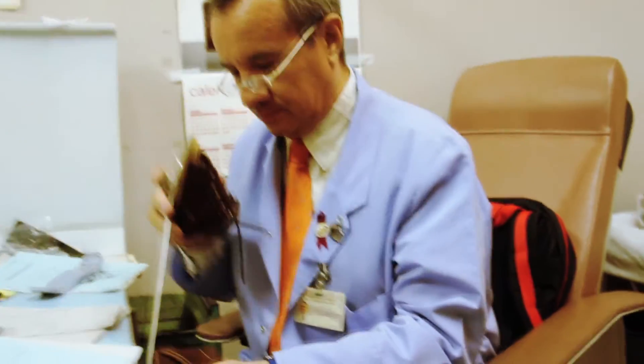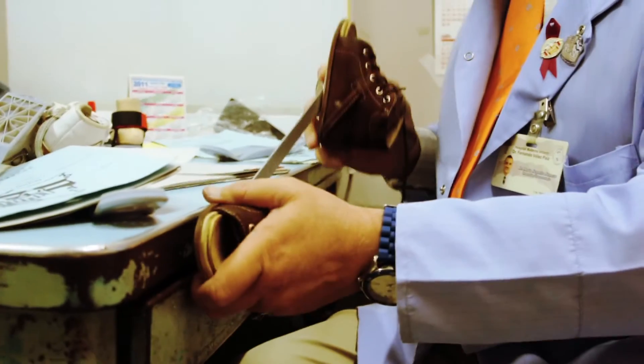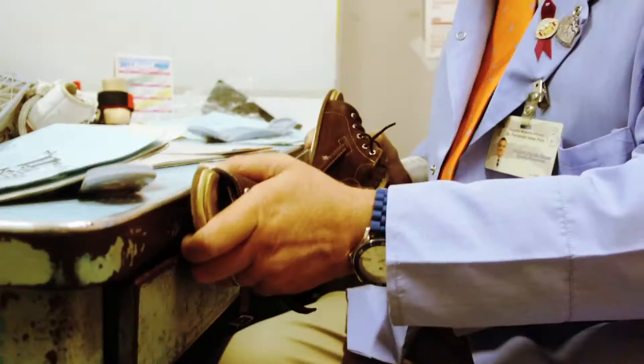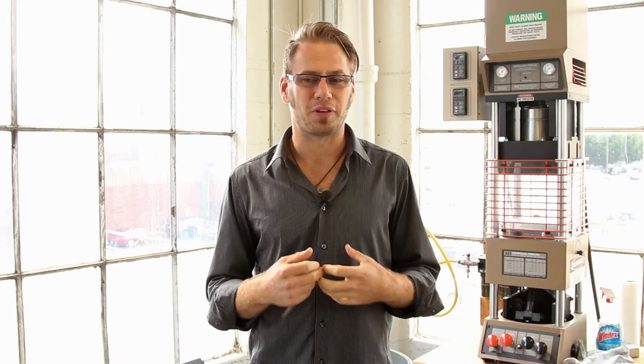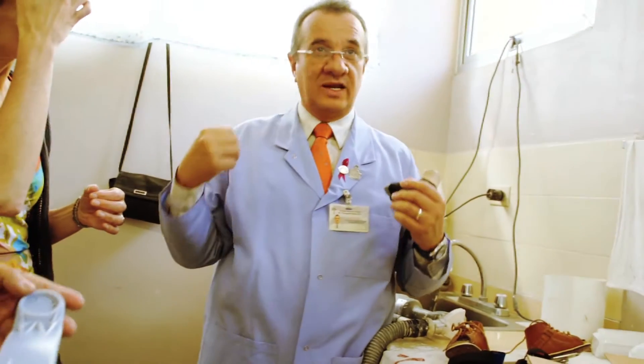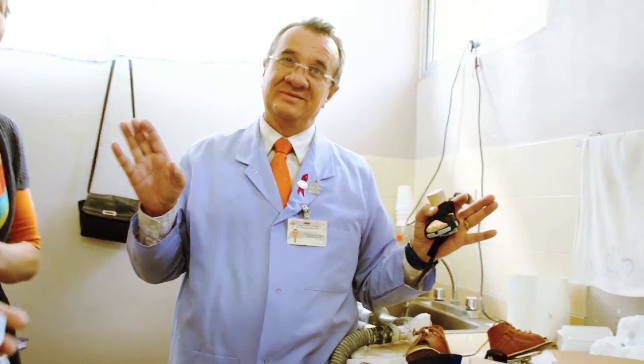We want doctors to be able to assemble this — doctors in developing countries. I remember the doctor in Nicaragua. He had one tool and that was his desk. He would put everything on his desk — bend things there, use it as a clamp for turning wing nuts. It's easy when you're around all this high-tech equipment to try to make something really high tech. But if you send something high tech to a developing country, it's completely foreign to them and they may not accept it.